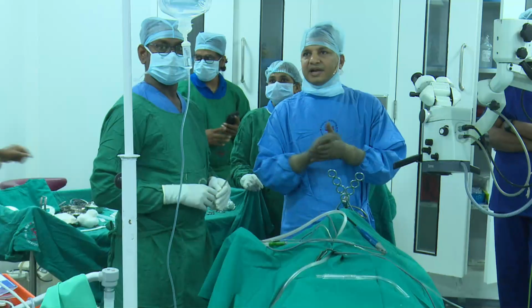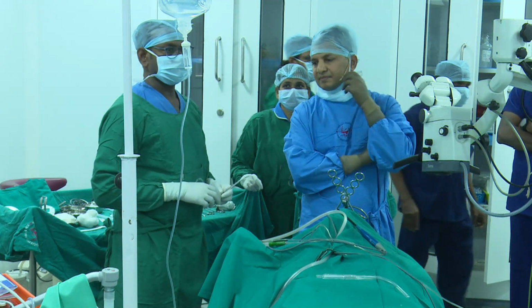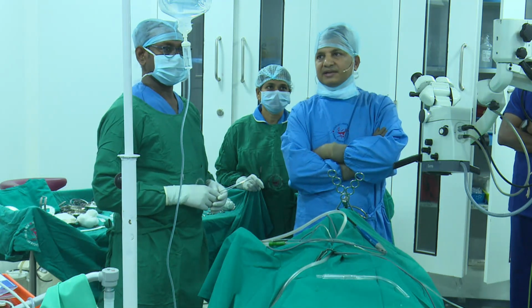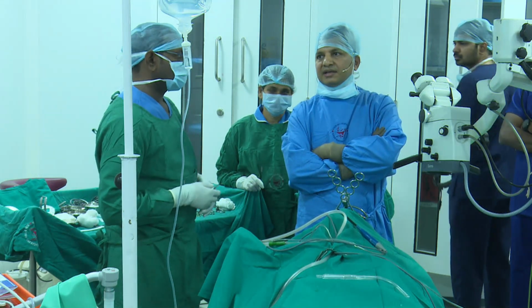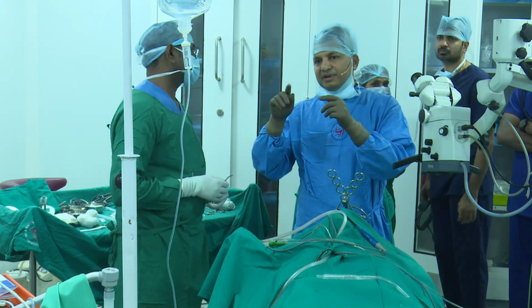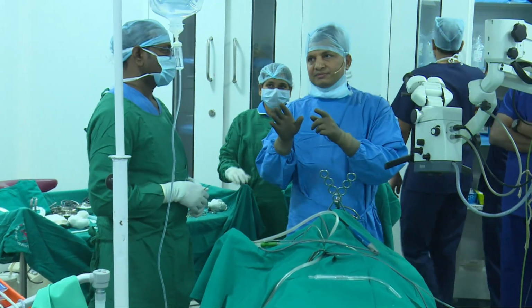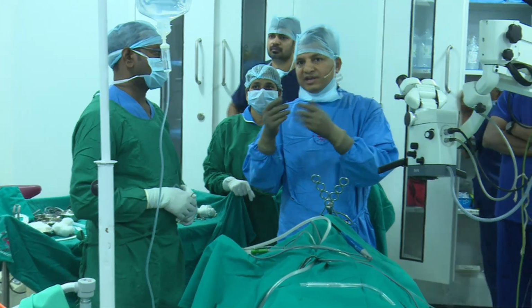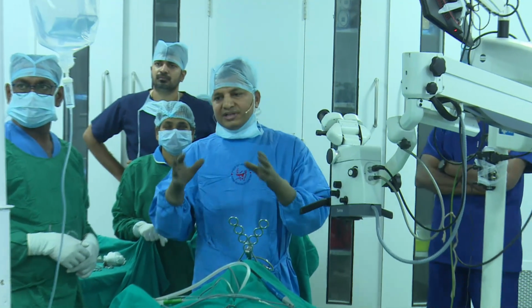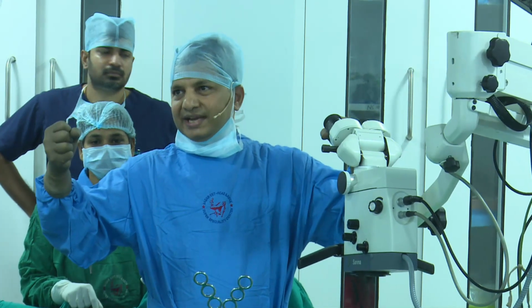External camera, please. Sir, you are using different types of box sutures. Yes. First absorbable, then non-absorbable. Right, sir. Why can't you use non-absorbable alone? Correct. So on the lateral side, my sutures are 2-3 loops and they are exposed. You cannot have a non-exposed suture on the lateral side. And what we want is 15 to 20 days, the flaps will take up.